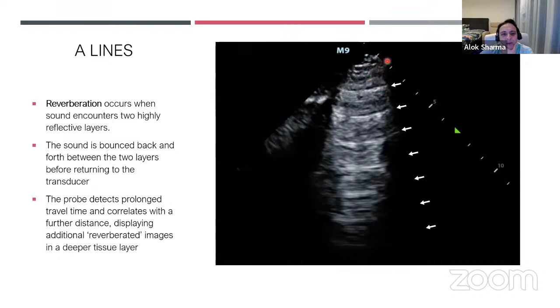And then they reflect back between the pleura and lung tissue and you have deeper lung tissue. So basically you have this kind of reflection of sound waves in between these areas. And this causes what we call horizontal reverberations, which classically produce A-lines. Depending on attenuation, and you can see that actually there's not too much attenuation in this particular lung field.